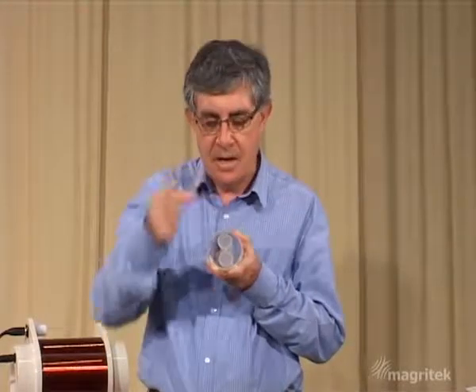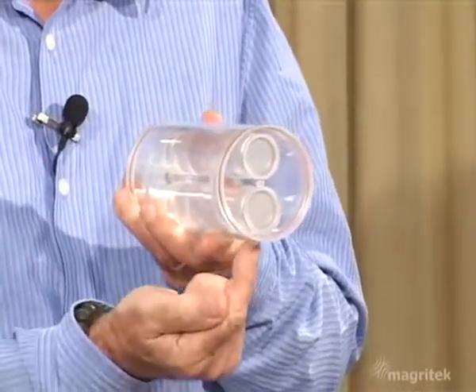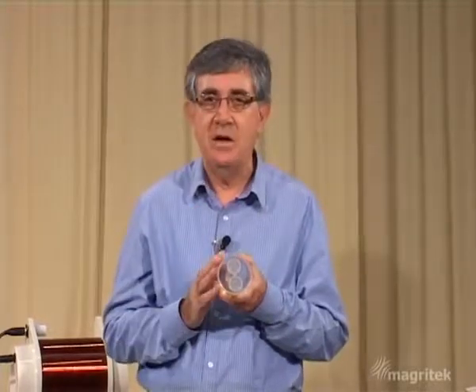Remember that the Larmor precession frequency of the nuclear spins depends upon the strength of the magnetic field. Now just imagine if we could make the magnetic field higher on the top tube and lower on the bottom tube. That would mean that the top tube would have a higher frequency and the bottom tube would have a lower frequency. And if we looked at the spectrum of that, we should see two signals at two different frequencies corresponding to the two tubes of water.